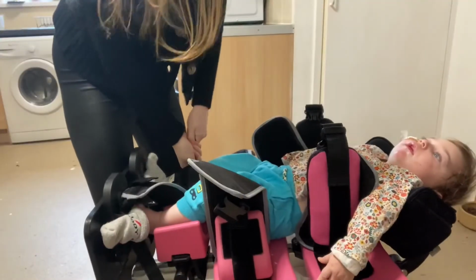when you're developing as a baby, you need to put pressure down through your hip joints, in your legs and all that kind of thing, because if you don't put that pressure on, your hips don't round out properly. If you know the bone structure of the hips, it's like you've got two plug sockets almost that the thigh bones go into, and if you don't stand up much, this can be not very curved, and it won't fit very well, so you can get dislocated hips and all sorts of nasty things like that. So the standing frame helps with that.